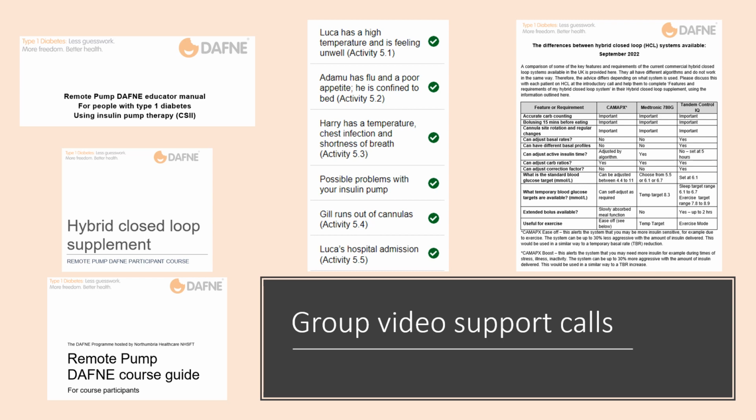To help you to find the activities online, the activity numbers are shown in the tabs on the left of the screen. As mentioned previously, the time for each call is estimated as 3.5 hours for weeks 1 to 4, 4 hours for week 5, to allow for participants to check and change pump settings if required. We recommend you have pump manuals for quick guides to hand for the pumps used by participants.